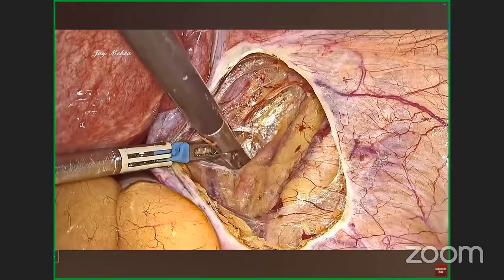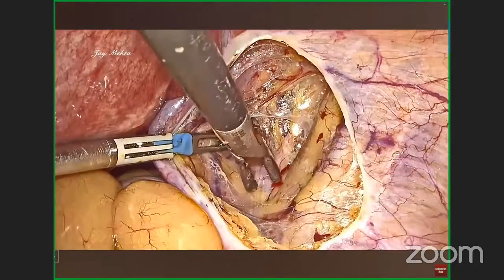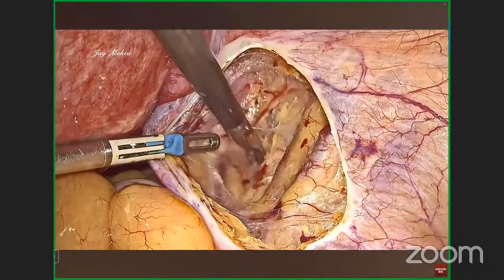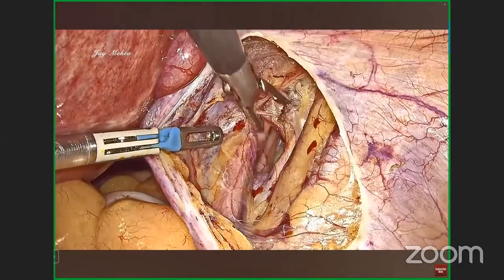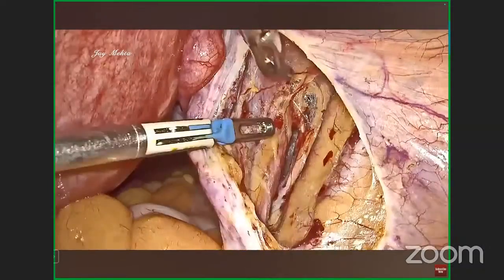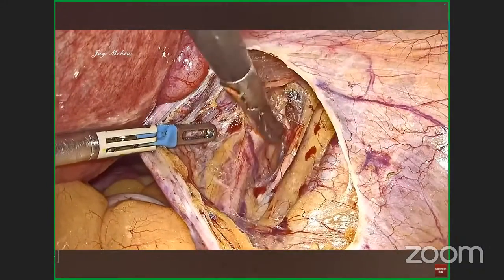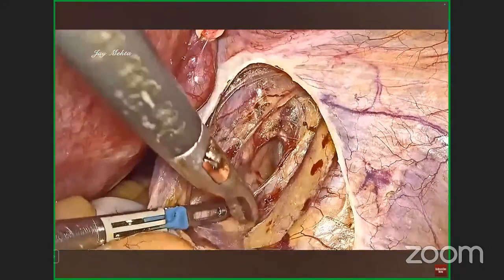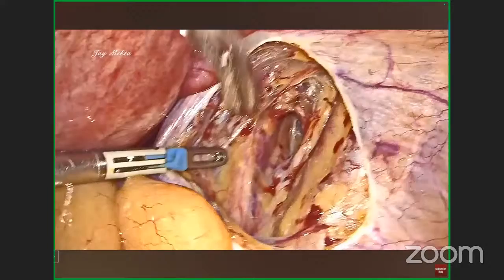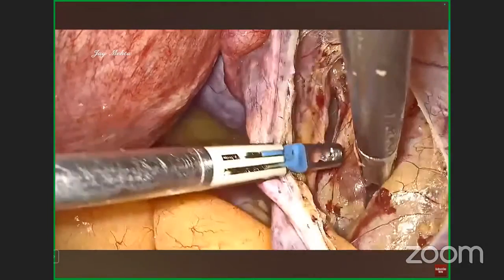Okay, fine. This is important, guys. Just divergent forces of traction and open. This is a live video, as you see, and the live video is also as simple as it is. Can you see that? Just use divergent traction. Finished.